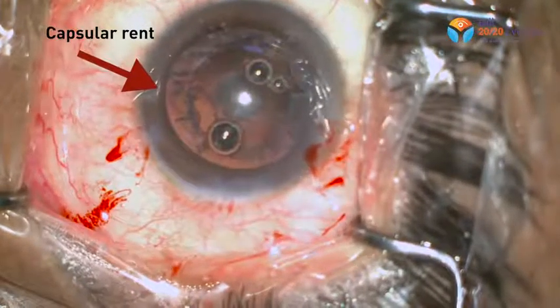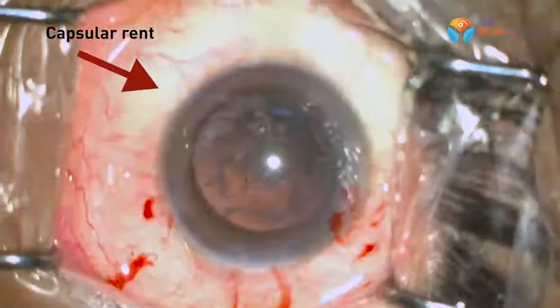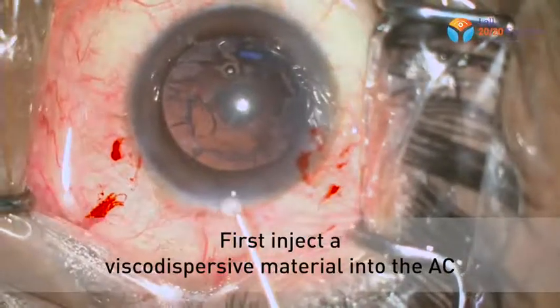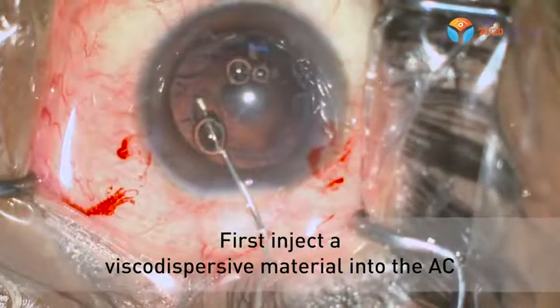Here we present a real-life situation where one of our surgeons, while trying to remove cortex with a phaco probe, ended up with a capsular rent. As I noticed the rent, I asked the surgeon to just stop, remove the phaco probe, and put a visco-dispersive viscoelastic into the anterior chamber.